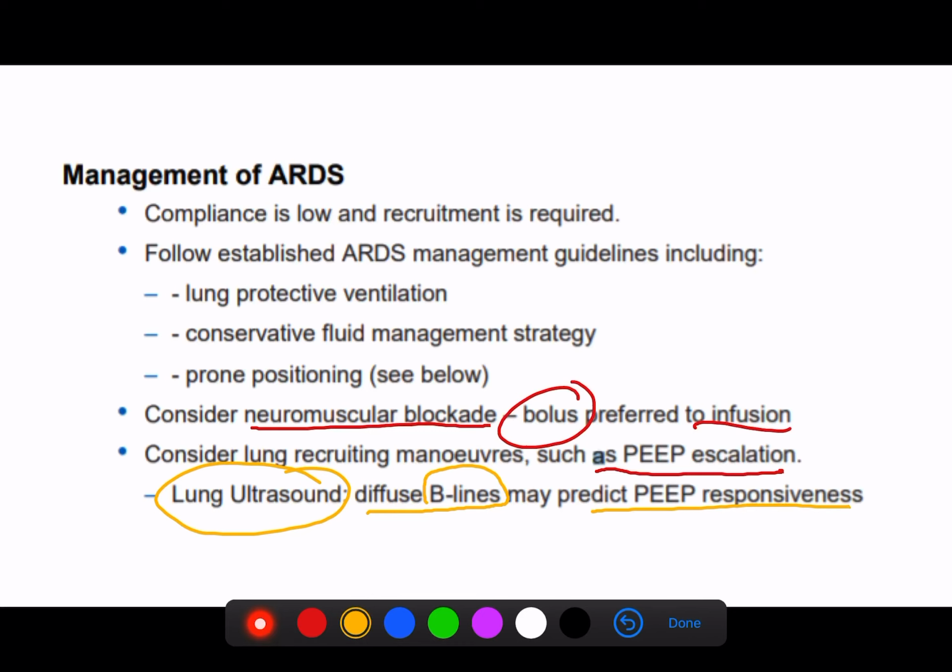And that's because all patients have some degree of atelectasis, and that can be improved by just providing a bit of continuous positive airway pressure. And like I say, APRV is my mode of choice really, because I think it causes a lot less alveolar instability, reduces the risk of atelectrauma, and therefore may well be better for the lung in the longer term.